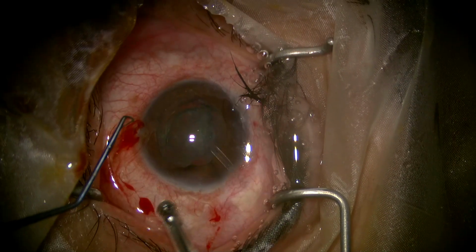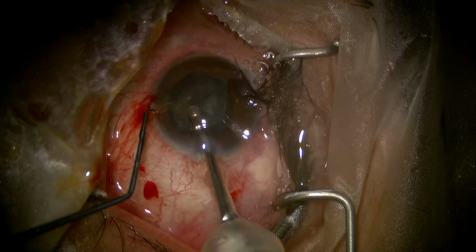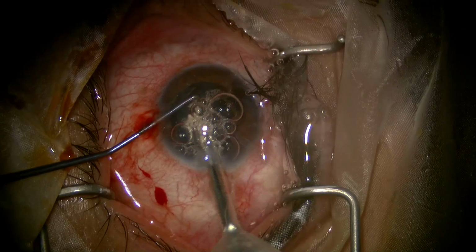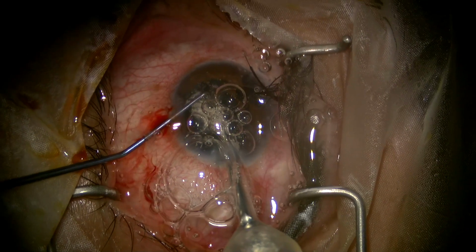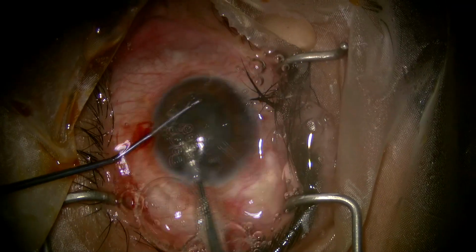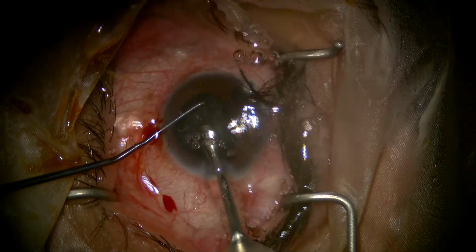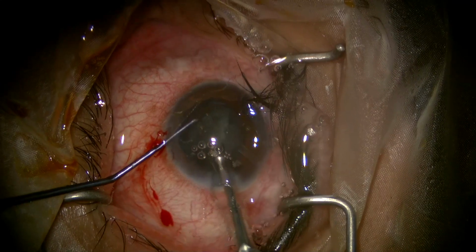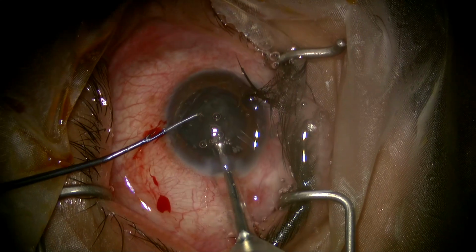So it's a case of secondary glaucoma due to uveitis. So minimum handling of the uveal tissue should be done during the surgery. We are carefully, slowly removing the cataractous lens.